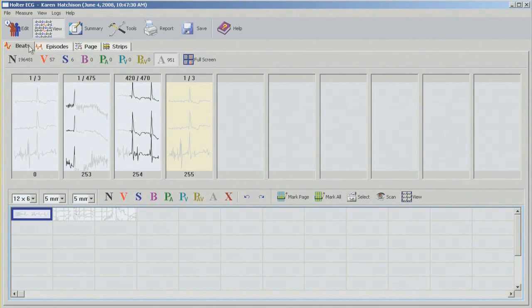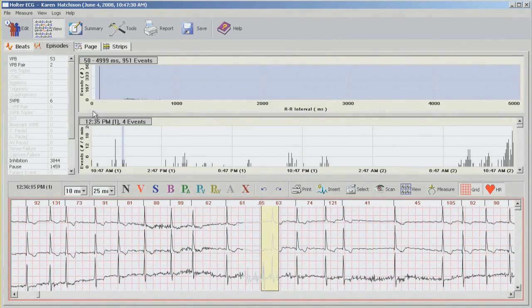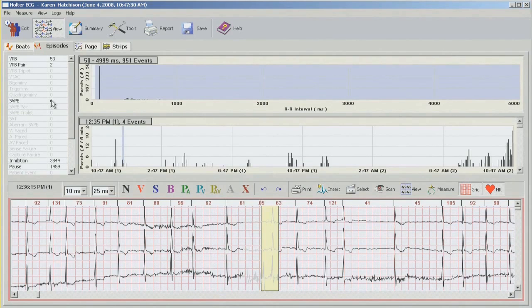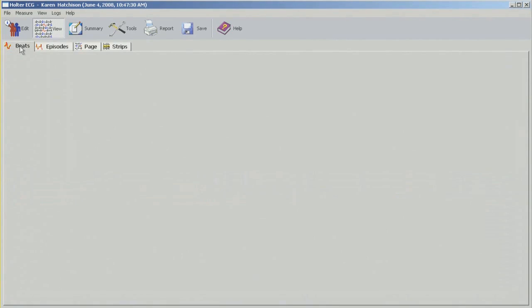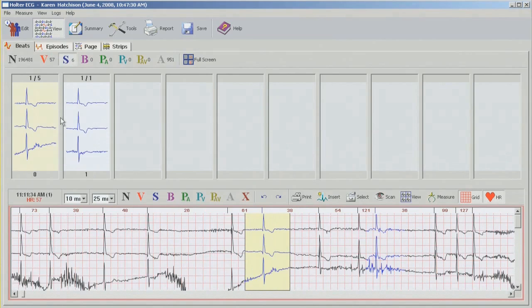The next move is to go into episodes since we're working left to right. So in the episodes, we will have those SVPBs which popped in when we changed those beats to normal and deleted those artifacts on the baseline. So before moving on, I want to go back and take care of those, changing them to normal.